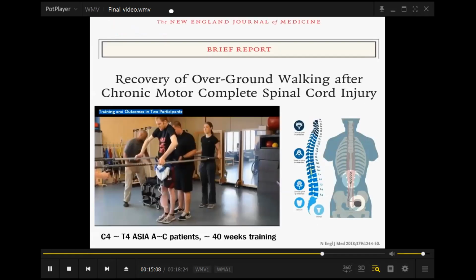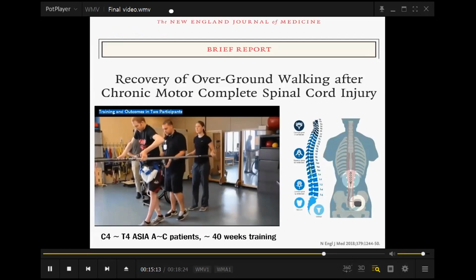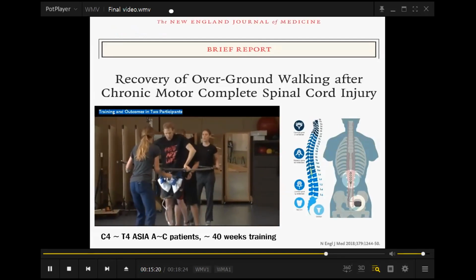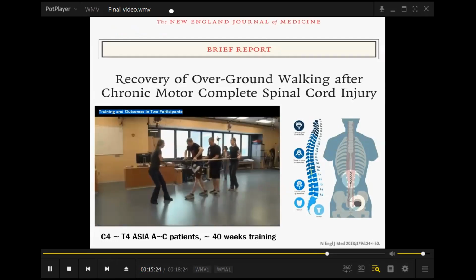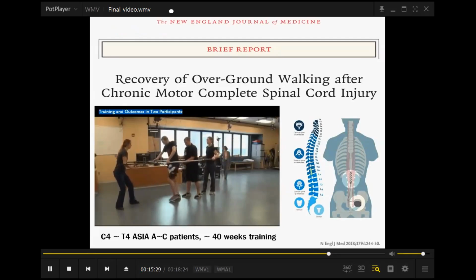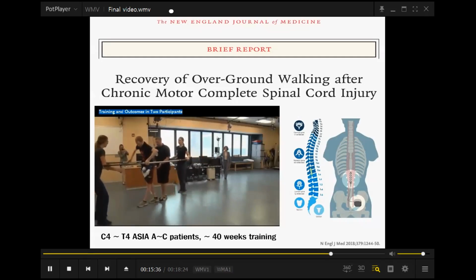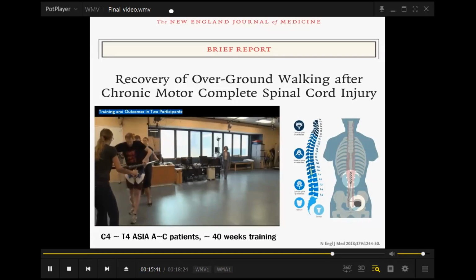Second is integration with functional electrical stimulation. This paper published in the New England Journal of Medicine in 2018 caused quite a sensation in the academic community. I also personally found it very interesting to read. In fact, this system operates in a classical manner, not by moving the legs through individual muscles controlled by electrical stimulation, but by increasing sensory input to induce motor output.